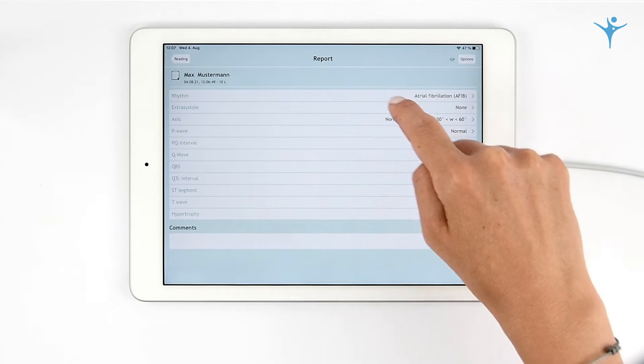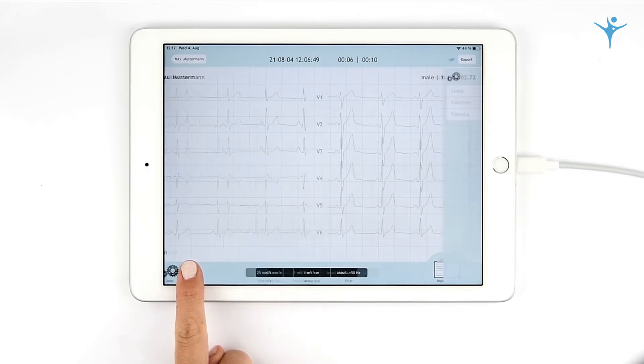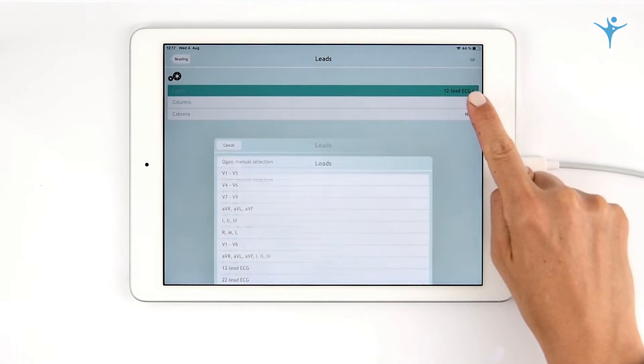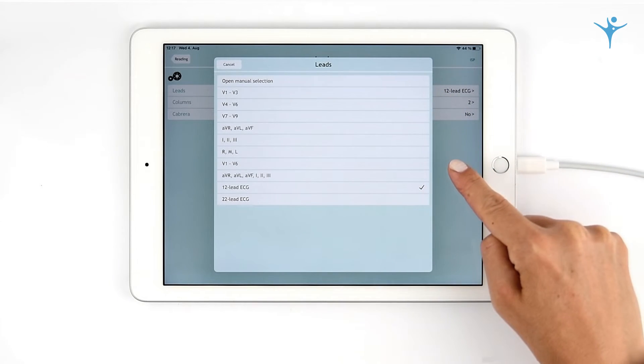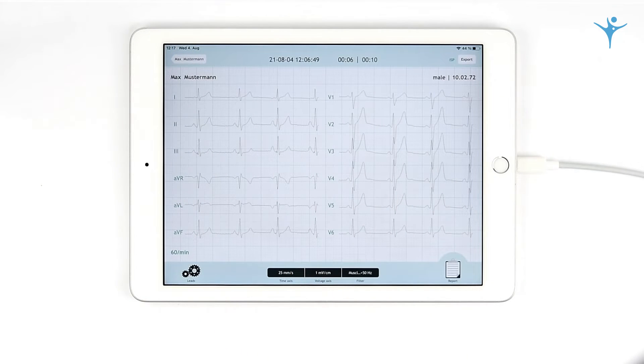Cardio Secure Pro offers you standard ECG settings such as leads. Simply select your preferred leads and display format, speed, voltage, and filters.